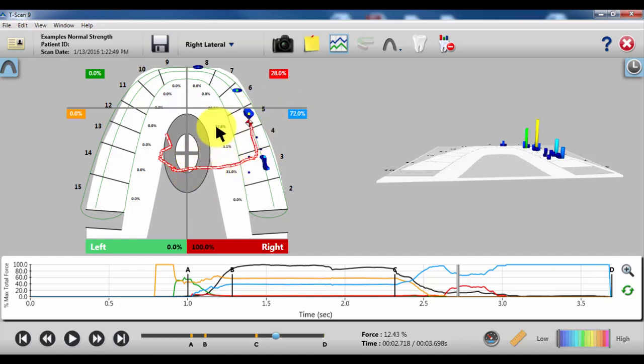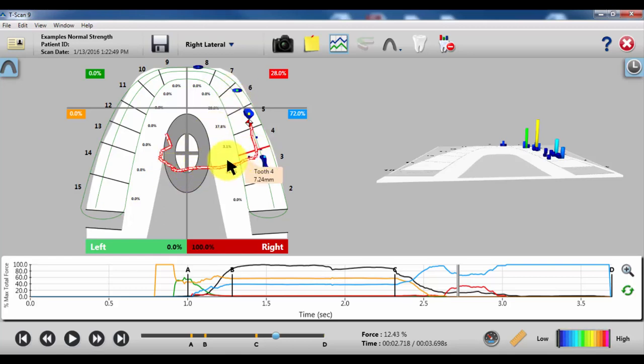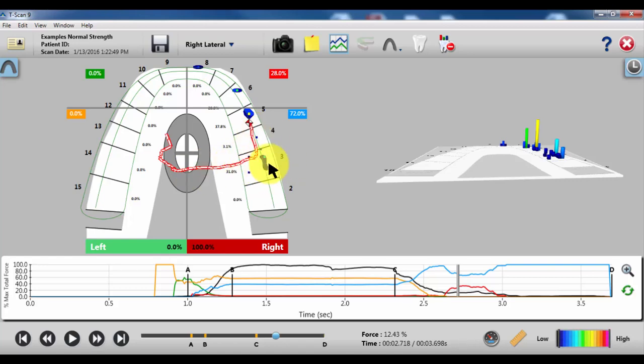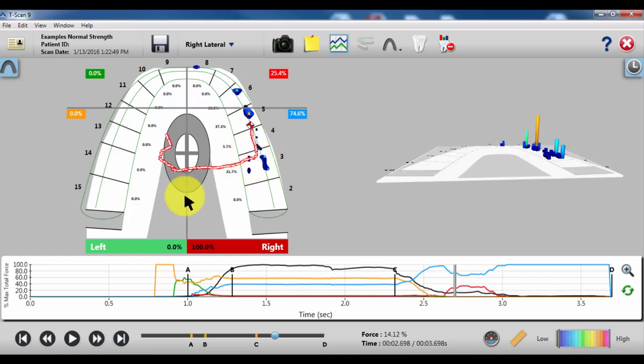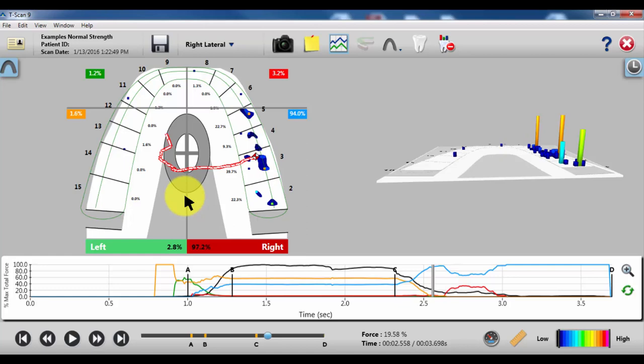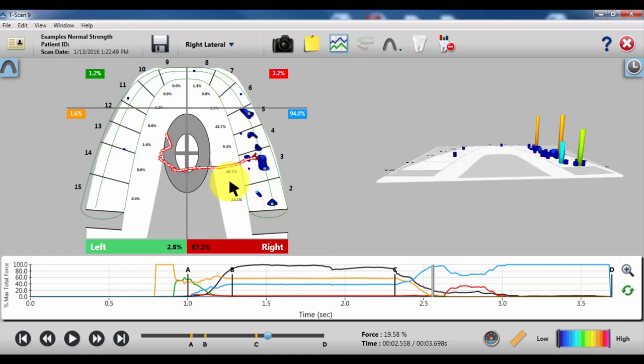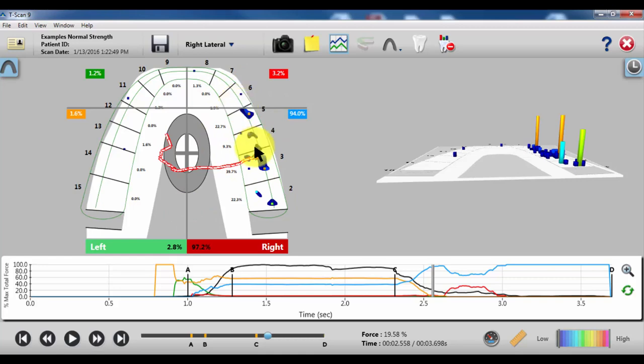Using this, we know that the patient, that the red line's horizontal, this indicates some type of group function on teeth 3, 4, and 5, which are clear. If I rewind this movie back to right before it moves north towards 5, we can see that you have a clear group function 2 through 5. This might be a starting point for an adjustment or an addition to the canine to make it steeper.